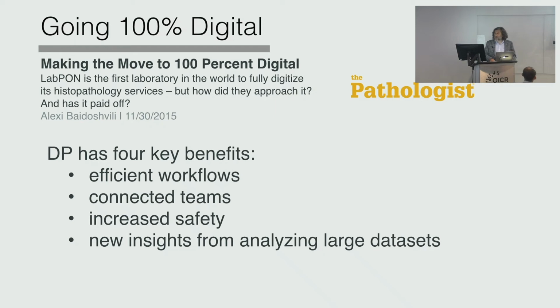So if you are looking for something specific, you cannot go in the basement of the hospital and grab 1,000 glass slides, bring them up, put them one by one under the microscope and show it to 10 different pathologists. You cannot do that. But in a digital context, this would be a matter of 30 minutes, full scale analysis.